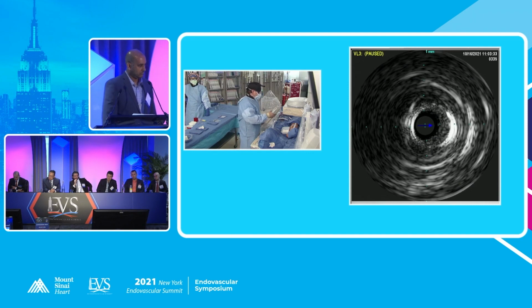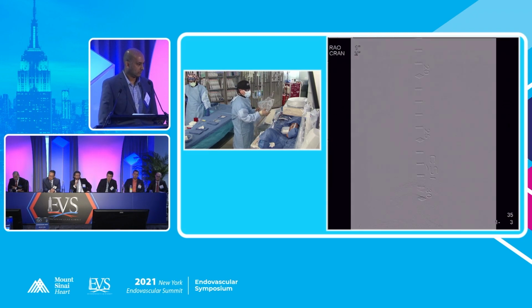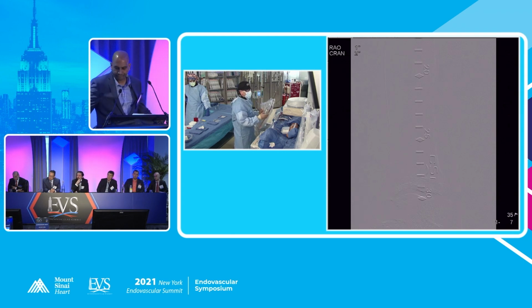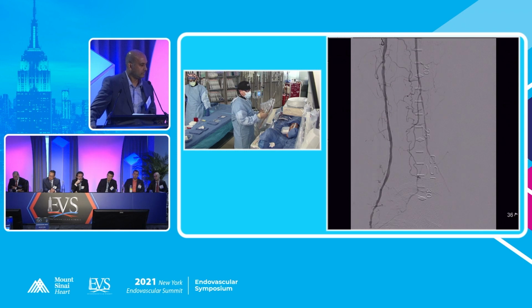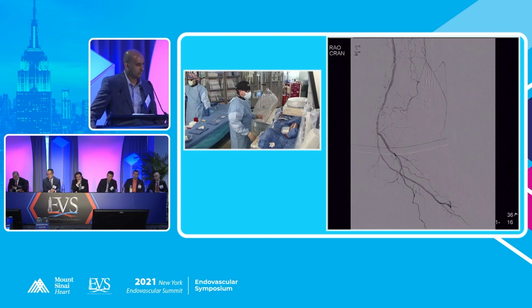Okay. And then let's take a look. Go back to our fluoro, please. All right. So there's the IVUS we just showed you. And here's the pictures distally. They're just making sure there's no recoil. Sorry. And then here's the foot. You got a wire all the way down the foot, and the other vessels coming in. No distal embolization and good flow. The wound was down there in the plantar part of the heel. I think we're going to be okay there.